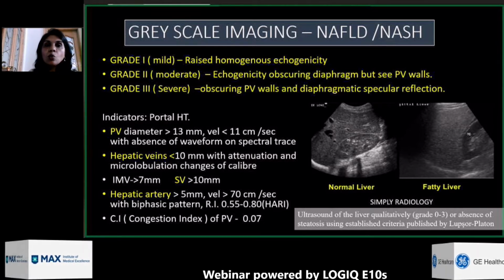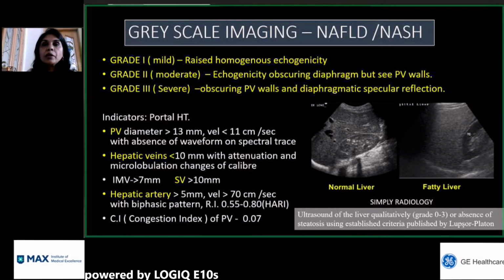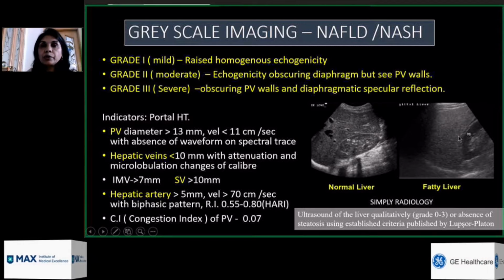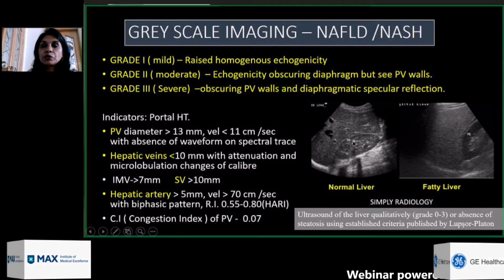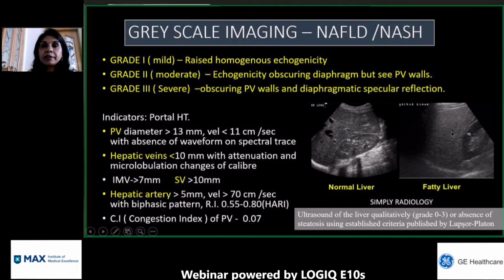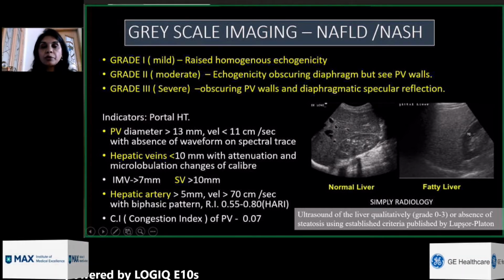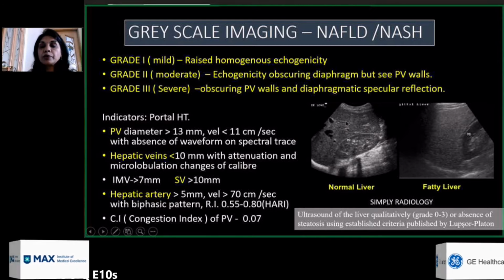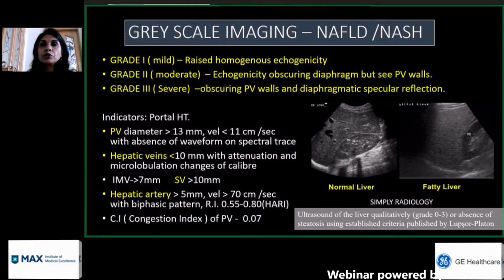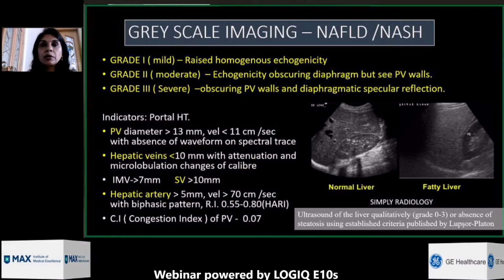So grade 1 has been defined as mild steatosis, where the liver shows bright, homogeneous, raised parenchymal echogenicity with round, smooth surface and contours instead of sharp ones, as you can see here. So, of course, the normal one and a fatty liver here. Apart from that, we see attenuation of the intraparenchymal vessels. As you can see, complete attenuation gives a characterless appearance to the liver due to increased interfaces, and these are created by the fat droplets that accumulate in the hepatocytes.